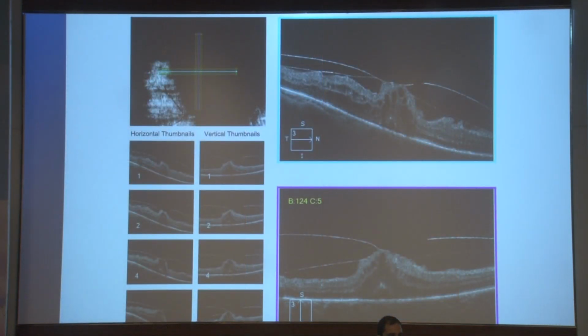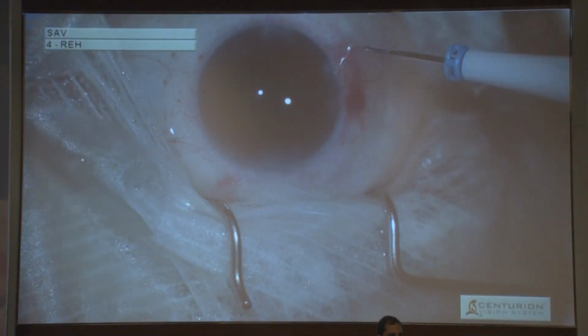So this is one more one-eyed patient who presented to us with a vitreomacular traction, one-eyed and quite disabled patient who had some macular edema and a vitreomacular traction. So this patient had to undergo a cataract surgery along with the vitreoretinal surgery.